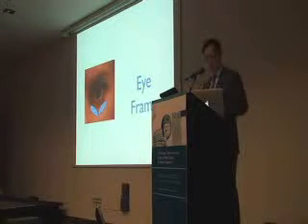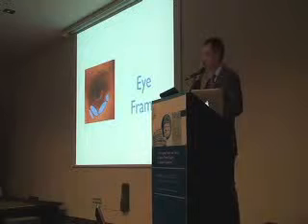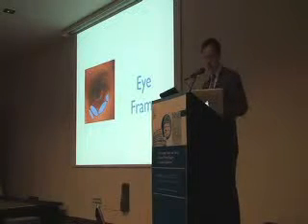Laterally, the nasojugal groove, the lateral canthus, and you really should focus on the lateral canthus through a separate entrance. When I was first doing fat and I wasn't targeting the lateral canthus, I would see a lateral dip. You really have to hit that as a separate area.